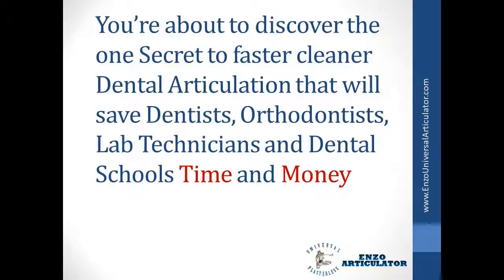You're about to discover the one secret to faster, cleaner dental articulation that will save dentists, orthodontists, lab technicians, and dental schools time and money.